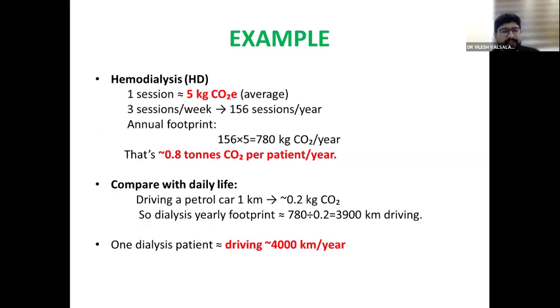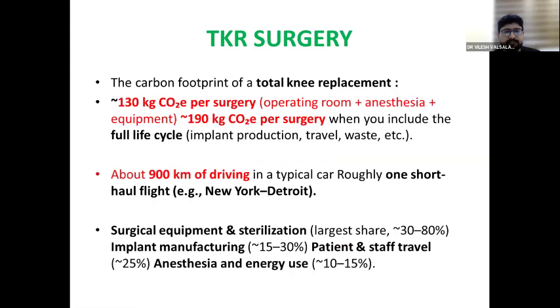And when you compare this with daily life, driving a petrol car 1 kilometer is equal to 0.2 kilograms of carbon dioxide. So a dialysis yearly footprint of around 780 kgs divided by 0.2 is driving a car up to 4,000 kilometers per year. That is the amount of pollution and waste we generate while doing dialysis sessions.